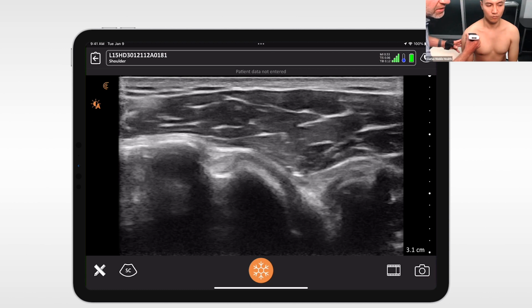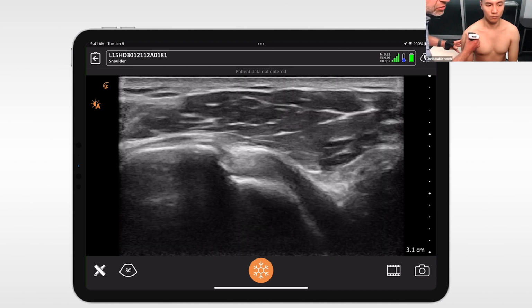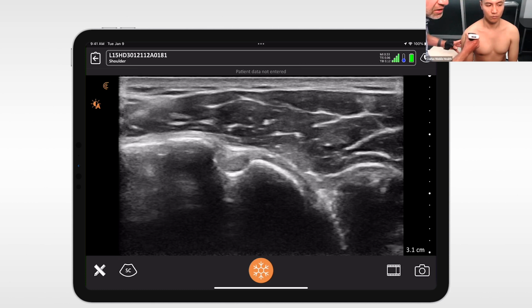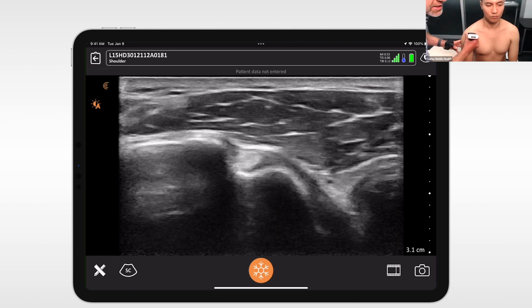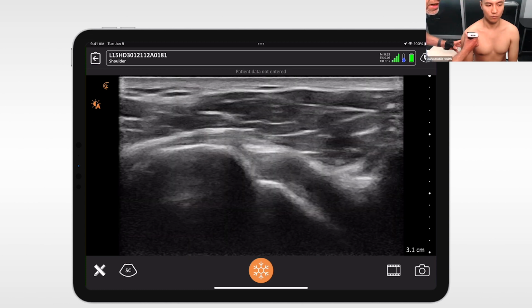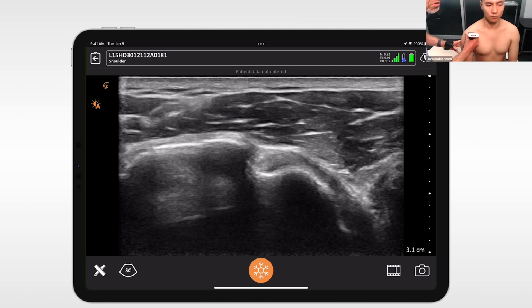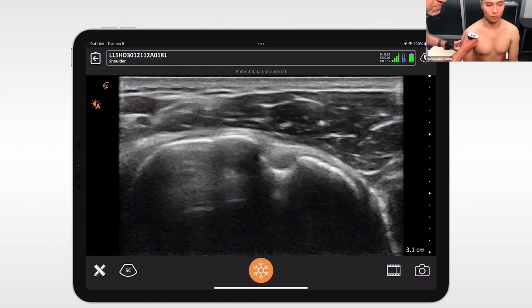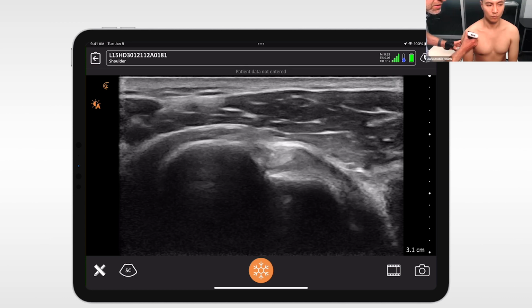Where you see the tendon, and it's tricky. I see a lot of people who are learning musculoskeletal ultrasound think maybe that's fluid because it's dark. So you really need to sweep the transducer to make sure you're getting the tendon and not fooled by anisotropy of the tendon, thinking that it's fluid or a tear. Yeah, and keep the transducer a little bit oblique, then it's even better to visualize. Yes, that's better. And a little bit more proximal, and then you end up at the rotator interval. So that's great.